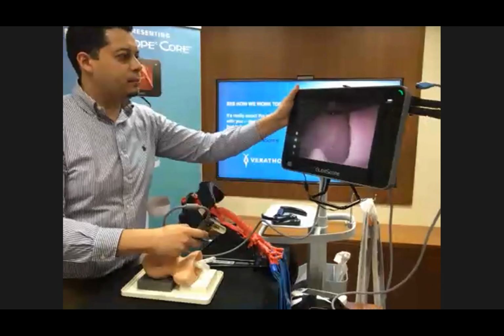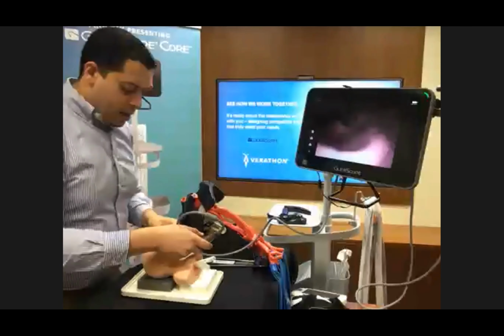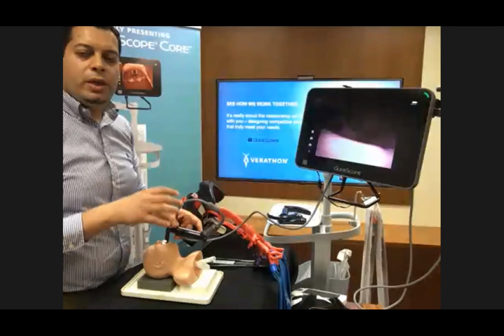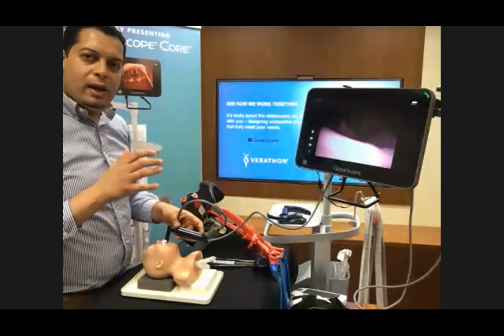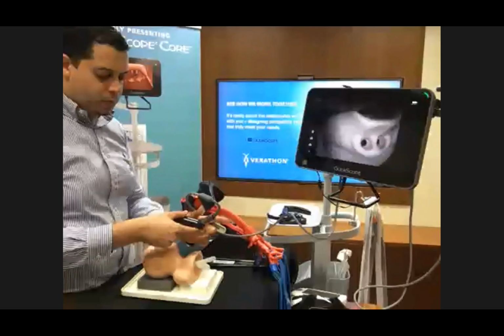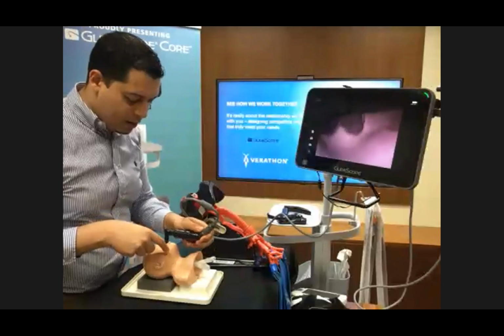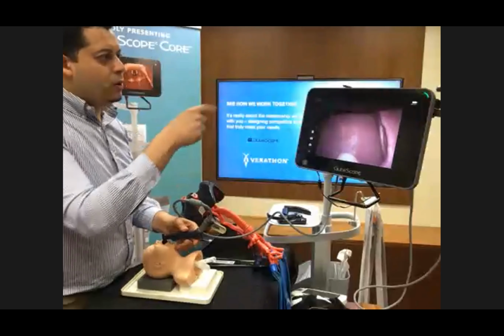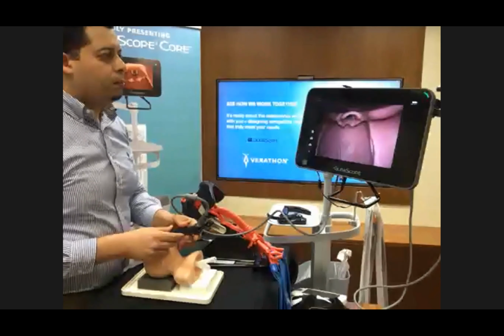Intubation, as you can see here. I hope it's visual. So we saw earlier the four-step technique where we use it on GlideScope, and it's very helpful type of tips where we might be able to look into the mouth of the patient and drop the blade and then look at the screen.